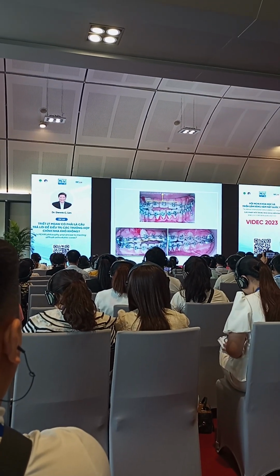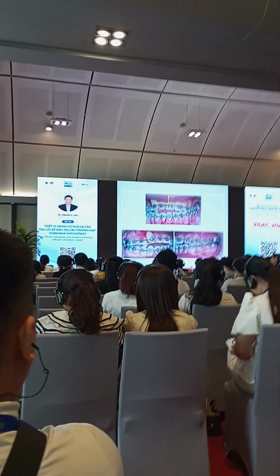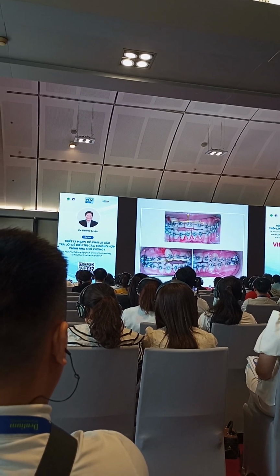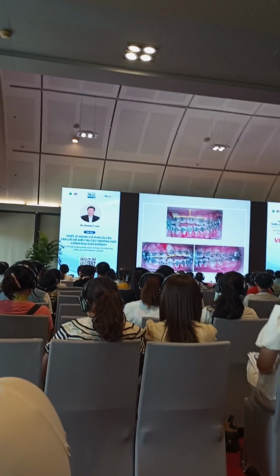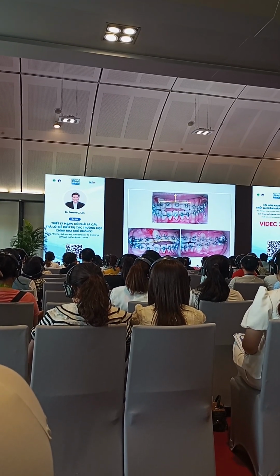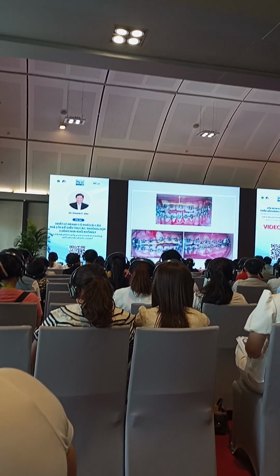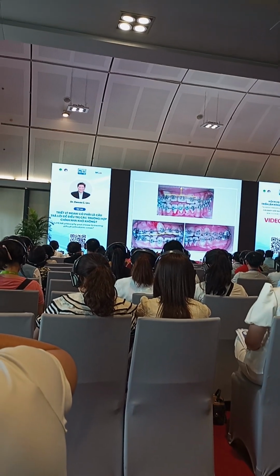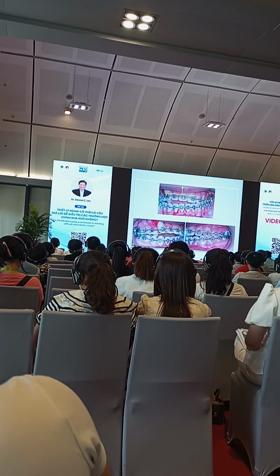Okay. Why does it happen? Because I made a mistake in my wire of choice. Okay. Instead of preventing the canting, okay, I created the canting wire because my base wire is a round wire. It is not strong enough, okay, when I was pulling my canine initially and bringing it down. The canine root is too long, okay, that the incisors went up, same level as the canine.